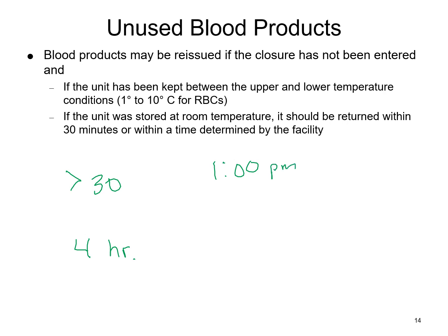So you let them know that as long as you issue it by, excuse me, I almost made a mistake there, 5 p.m. As long as you've got it infused by 5 p.m., you're good to go. So most of the time you can keep from having to dispose of that product. Now, if it was a situation that, let's just say it did set out for 45 minutes and for whatever reason they could not start that unit, if your facility doesn't have a particular policy in place of what to do with that, more than likely that unit's going to get tossed.